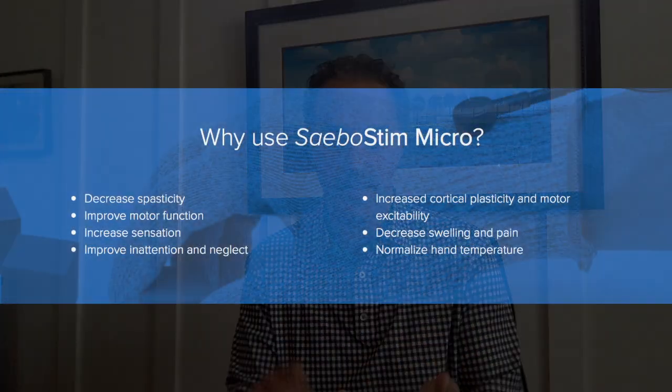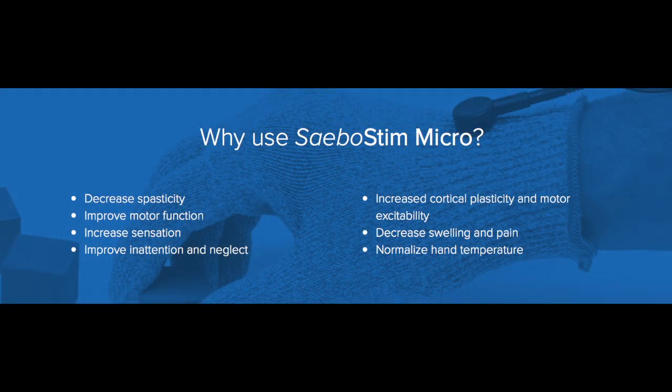I like to combine both the SaeboStim Micro, which is low sensory stimulation, for the reasons we just talked about, in addition to NMES. So you're going to actually contract the muscle and strengthen the muscle with the NMES, but you're also going to find some time throughout the home program to do sensory stimulation to improve sensation, decrease spasticity, cortical plasticity, improve weakness, motor neuron recruitment. You need to do both. And that's part of the important thing to remember when you think about the home program.